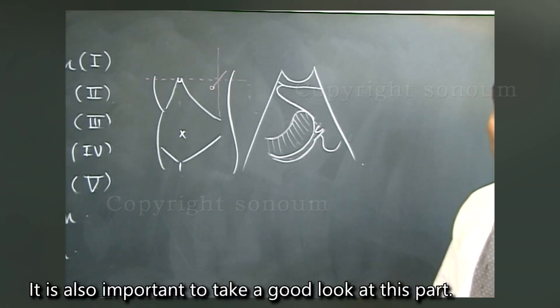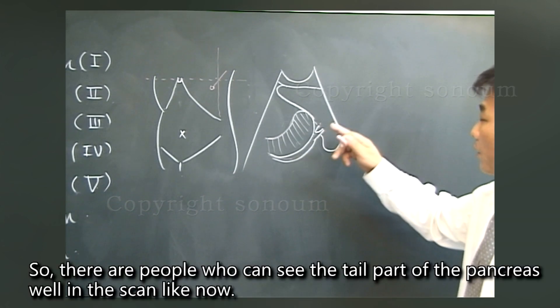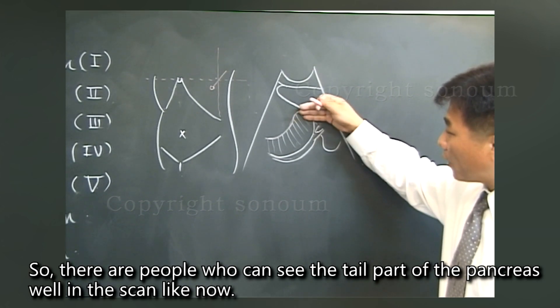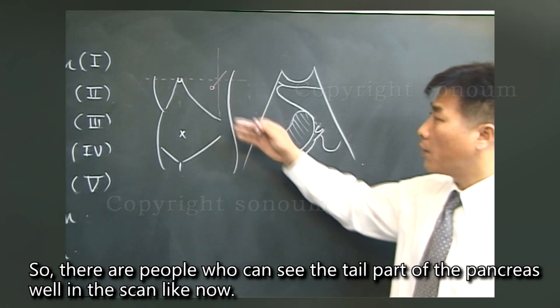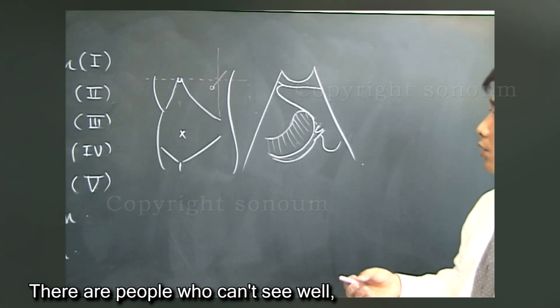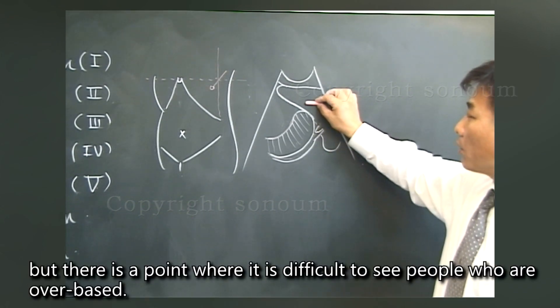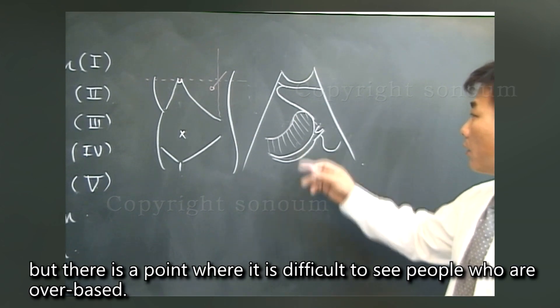If you have a tumor on the tail of the pancreas, first look at the splenic hilum — it is important to take a good look at this part. There are people who can see the tail of the pancreas well in this scan, and there are people who cannot, particularly those who are overweight.